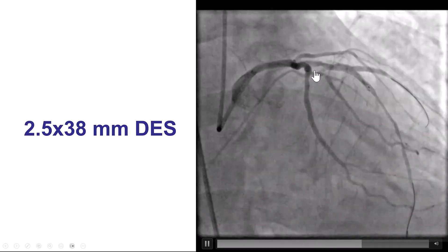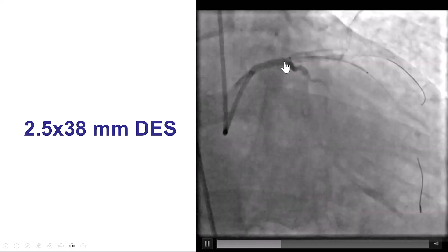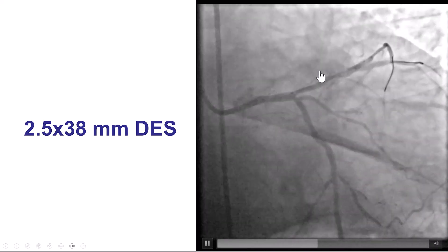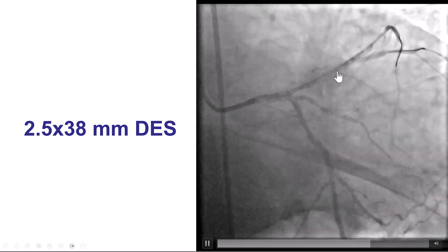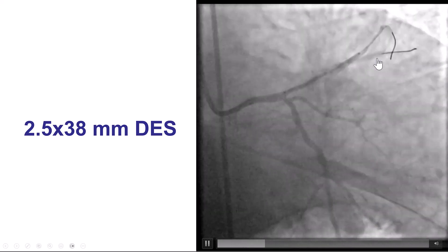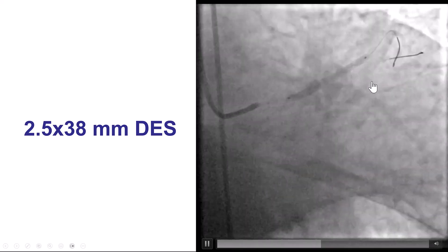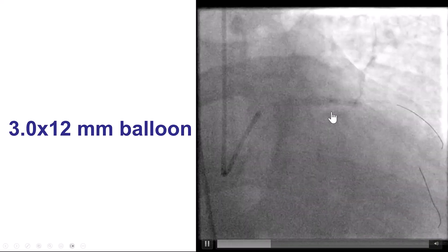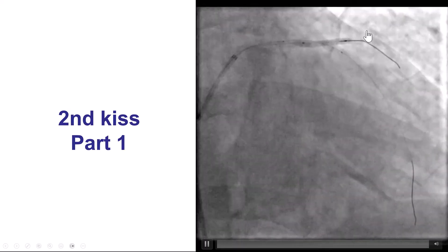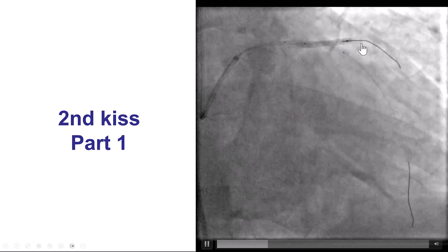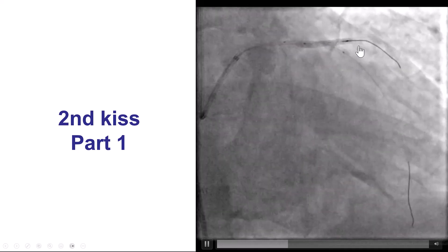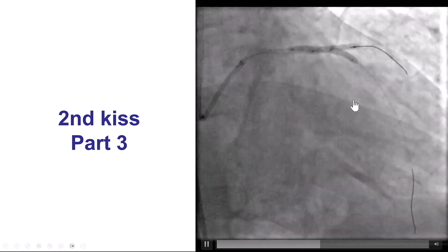We then placed a stent into the LAD, going all the way from the proximal to the mid. We used a different view to make sure we covered the proximal LAD lesion. After using proximal optimization, we were able to rewire into the circumflex and did the second kissing balloon inflation — 2.5 balloon into the diagonal, then into the LAD, then both together.